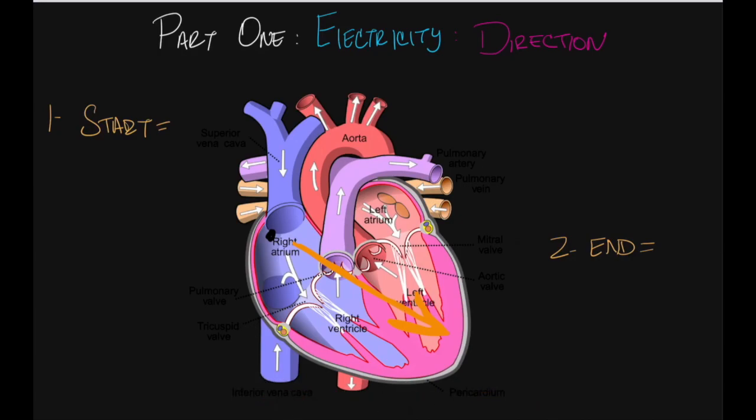And so if things start to change, for instance, if the electrical activity of the heart is moving this way, not towards the left ventricle, we're going to start to be able to say things about the right ventricle based off the activity of the electricity that we see on the 12 lead. Now, the one hurdle that we have to overcome is how do we as clinicians describe this change in the average electrical movement to other providers? What basis or what standard of measurement do we have that we can use?